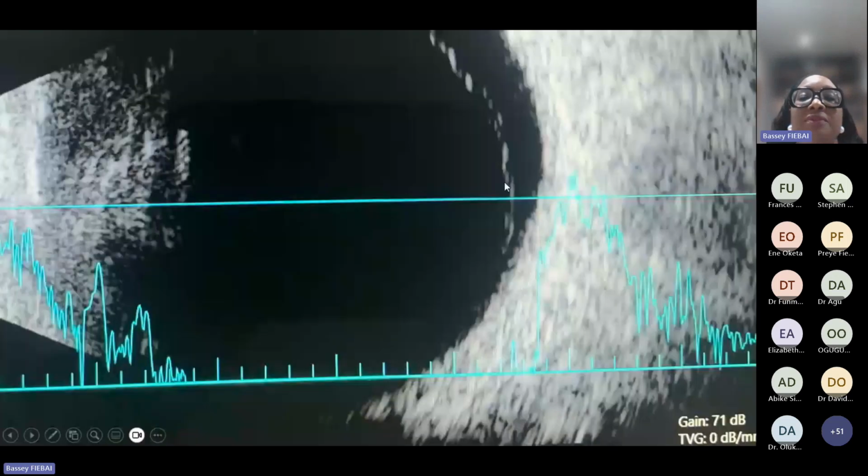So this was a patient I had, a 54-year-old who came in complaining of seeing a black line. When we did the scan, if you look at the spike here, you'll see that it is low to medium. Some people may confuse this with a retinal detachment. If it was a retinal detachment, the spike would be higher, but this is the spike for this membranous opacity that is hyperechoic, and it was detached from the optic nerve, so that could also confuse you. But this is a complete PVD because it was not attached.